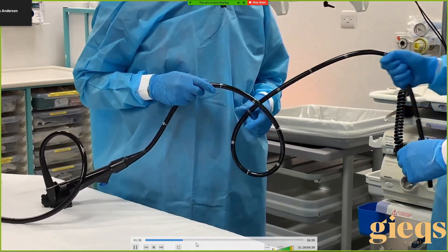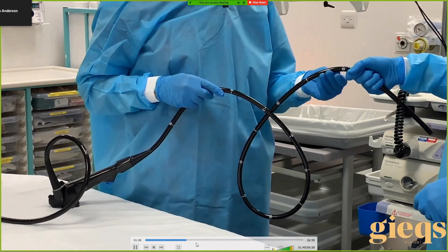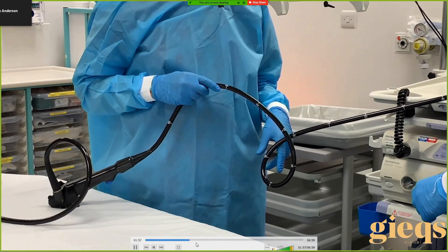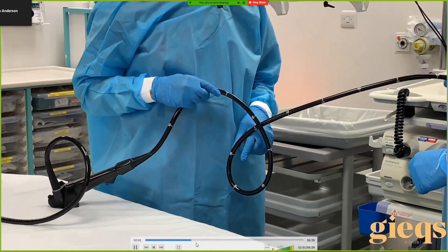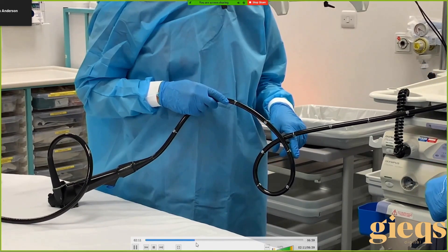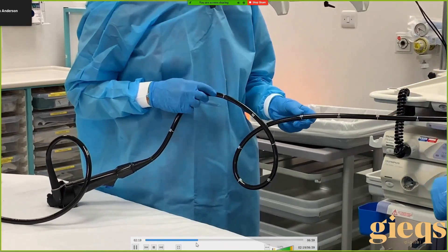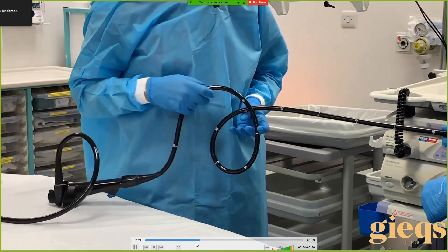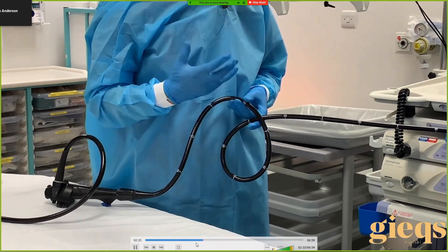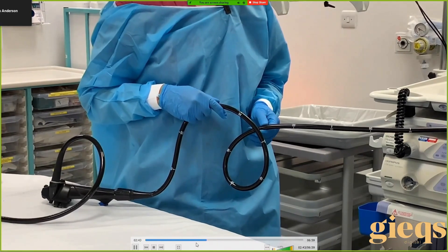Let's practice — close your eyes and pull the loop back nice and slowly, holding the scope in your fingertips. Feel what you start feeling. It starts to twist in my fingers. Before it started to twist, what did you feel? A bit of resistance. So before it starts to twist you feel resistance — as you make the loop smaller you start to feel resistance because the internal loop is becoming quite small and it's hard to pull it right on itself.